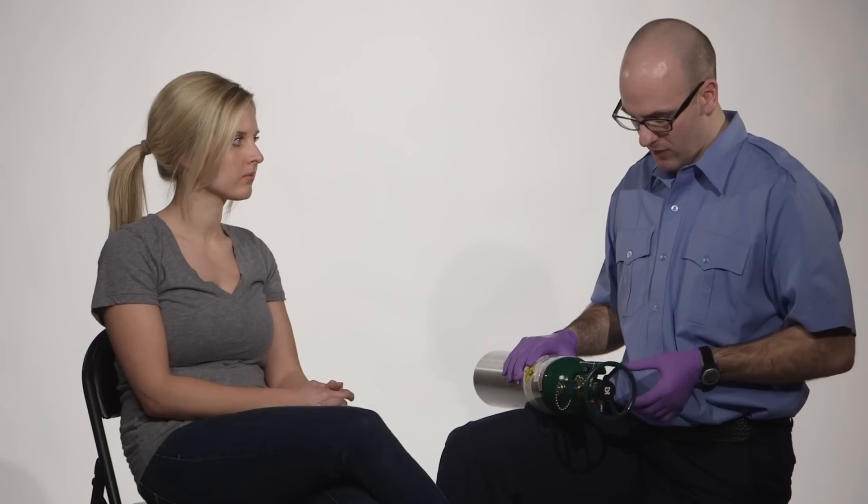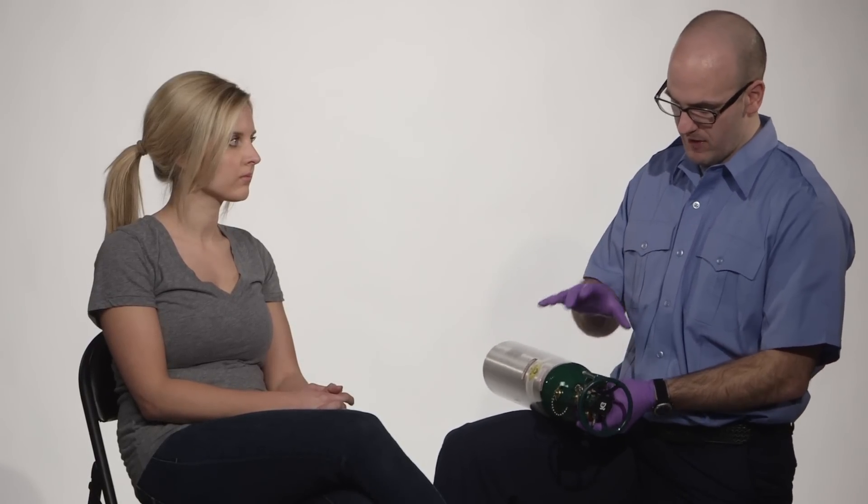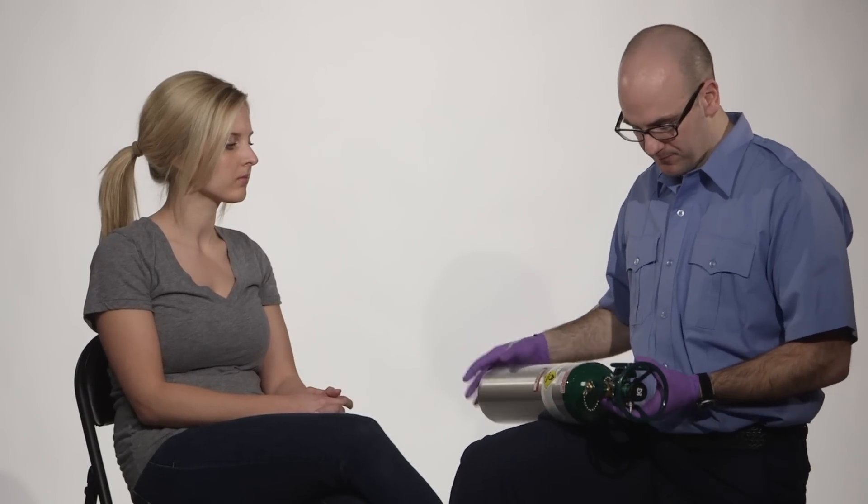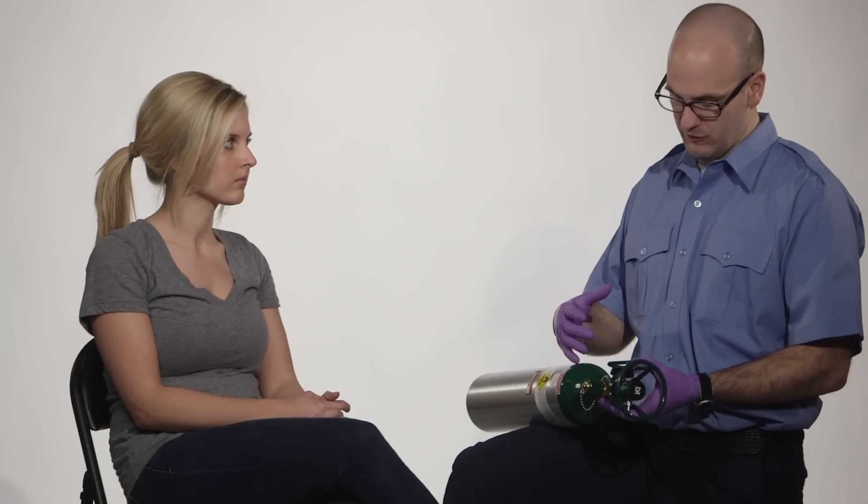First thing I'm going to do because of the particular tank I have, I'm going to just make sure that my regulator is on securely, that I don't have any leaks. If I needed to attach my regulator, I would do that at this time with this one. I don't have to.